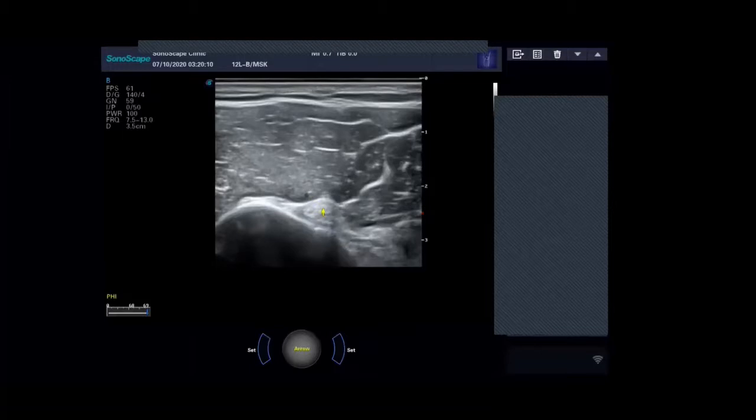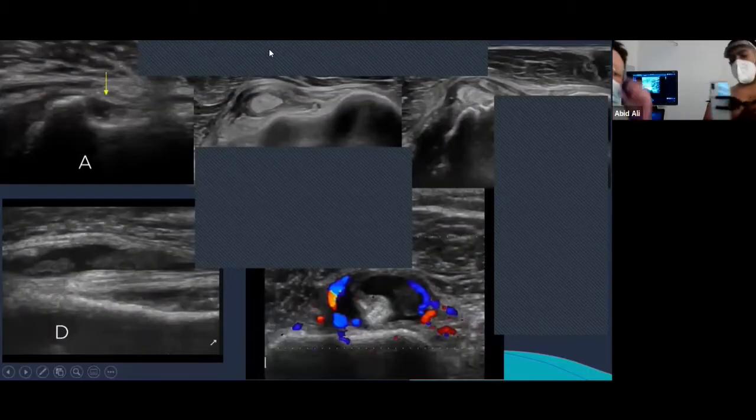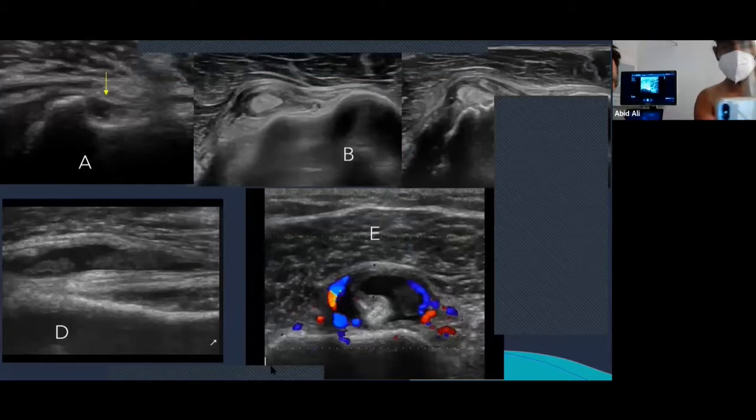Okay, let's see if I can go across onto the PowerPoint images now and show you a few of those while we're here. Right, so you can look at A. A there is showing you an empty bicipital groove, and you can see the blackness and the fluid. So that's a ruptured tendon, and you can't see the tendon in the groove. And obviously, what I do is look medially just to make sure it's not medially subluxed, but in this case, it wasn't.